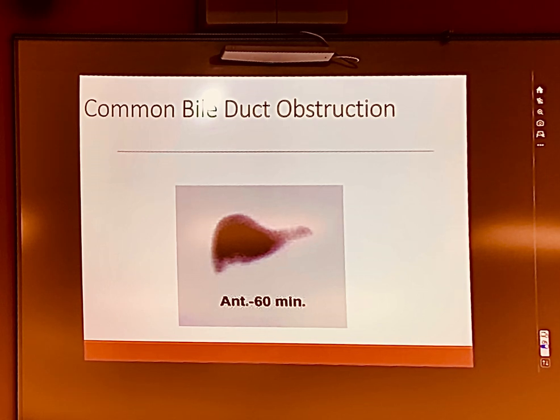Also, if you have a baby that's pictured that looks like this, this is exactly what biliary atresia looks like. Liver and nothing. Nothing, because there's no biliary tree to drain the bile out of the liver. So you got nothing.